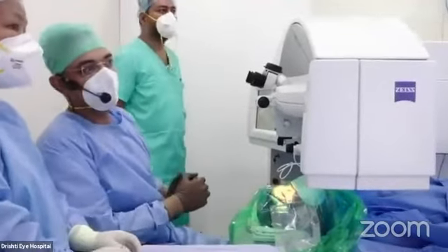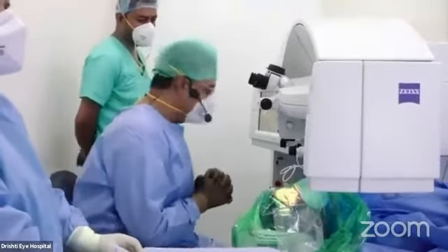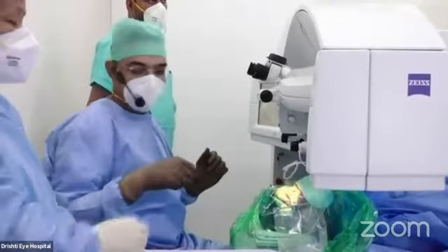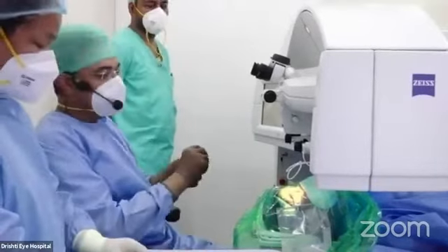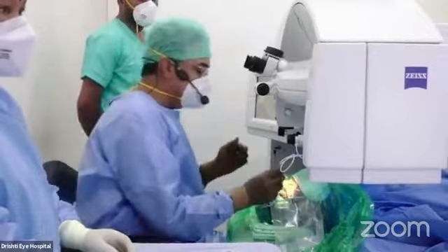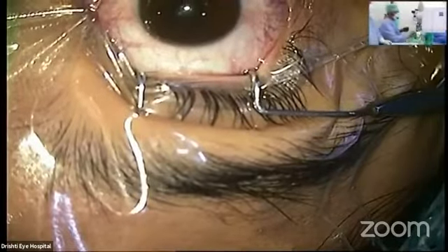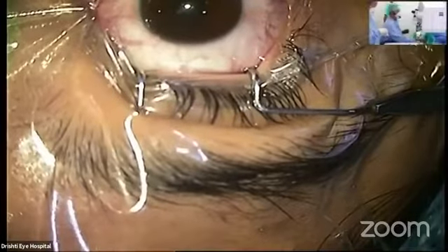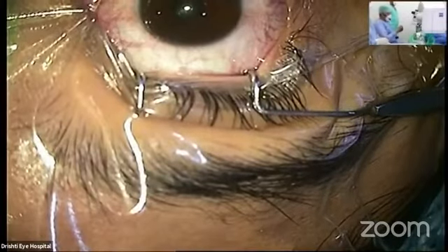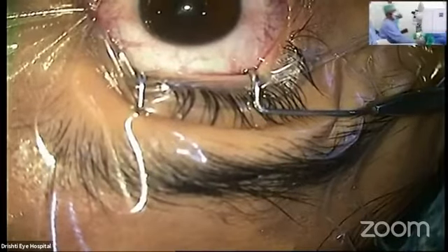Thanks, Dr. Amrita. I think we are all set. Patient is ready. She is a nurse herself and has kindly consented to be part of this live surgery program. The crucial thing is we are using the Visumax laser, which we've been using for about four or five years now. As Dr. Tithyal said, we are now doing predominantly SMILE, although I also do contoured LASIK in a good number of patients. For this patient, we chose SMILE — the corneal thickness was about 493, and our cutoff for SMILE is about 490. The correction is just about three and a half diopters with 1.5 cylinder, so we decided to go with SMILE.